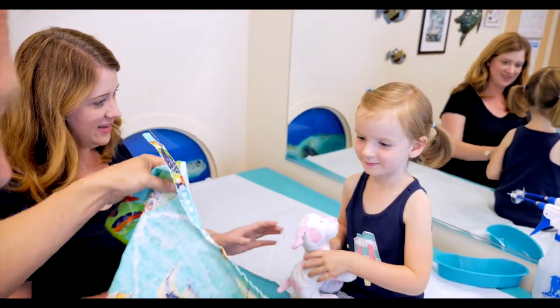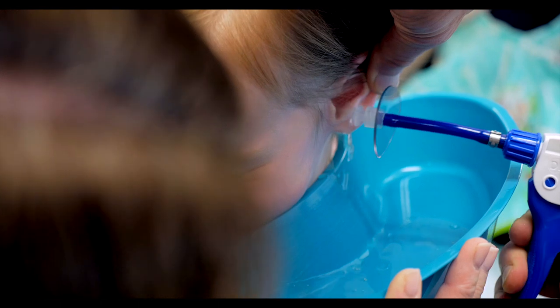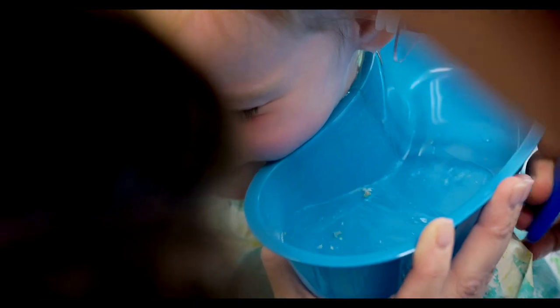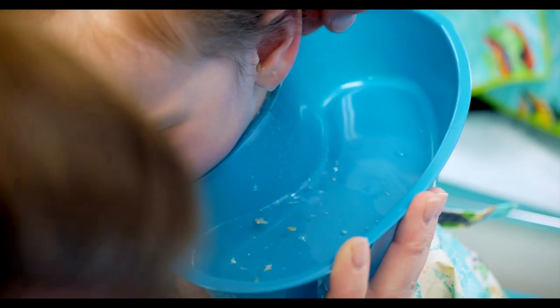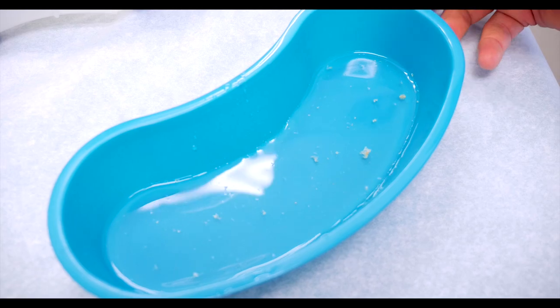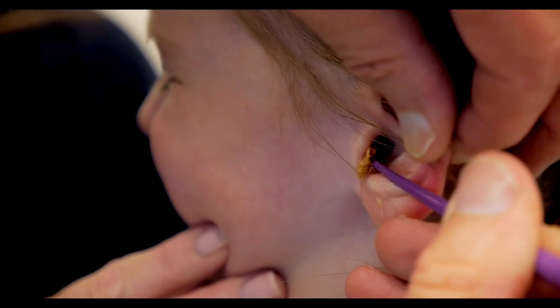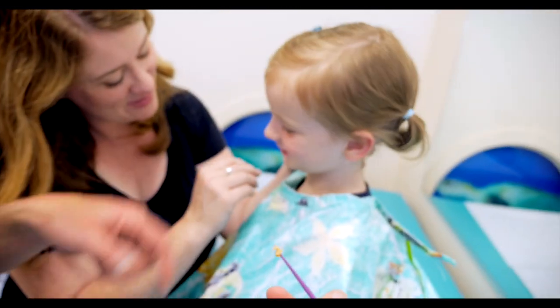So we have this very special bib that will help you not get soaked. There it is — floaters! We got a little floaty wax. You're doing great. There is a big old chunk of wax. Oh my goodness, Patrice — how is that big thing in your little tiny ear? Or that could be a gold nugget. We could make a little ring, like mom's ring. I have a gold ring. That would be on the gold ring.